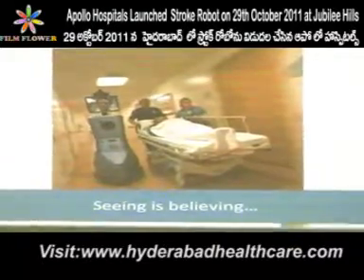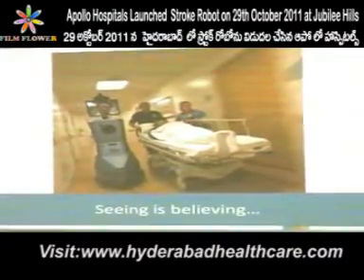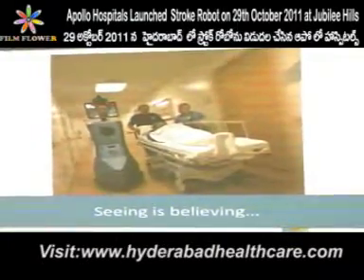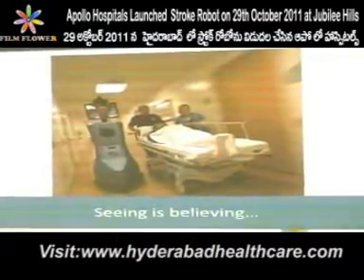But seeing is believing, and I would now like to present a demonstration of what this robot can actually do.